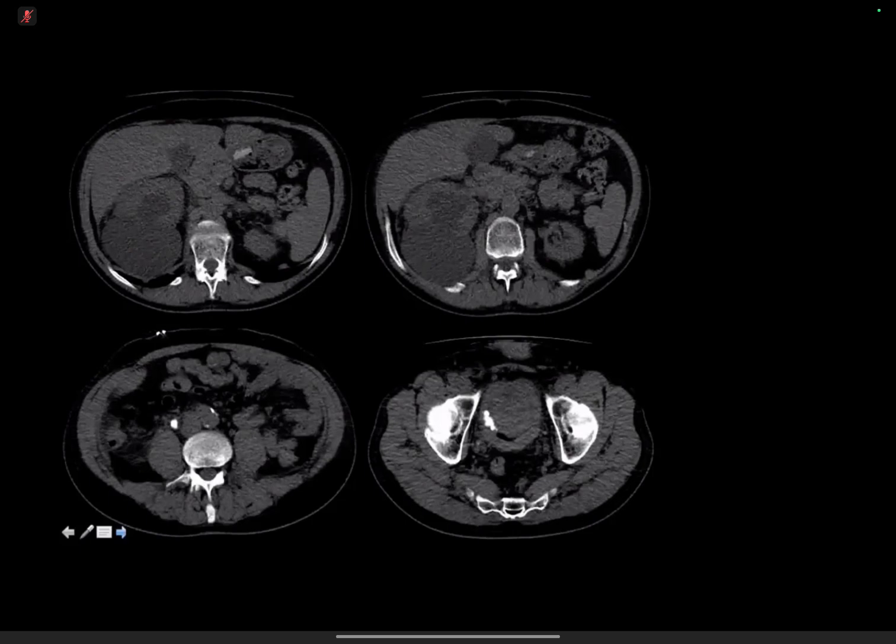Then we've got a cystic lesion arising from the inferior pole of the right kidney, but obviously I cannot measure the Hounsfield units. The characteristics appear quite simple, there's no fat stranding surrounding it, and it's a solitary lesion. There's also a size discrepancy between both kidneys. The rest of the abdominal organs appear unremarkable, and I cannot see any free air.